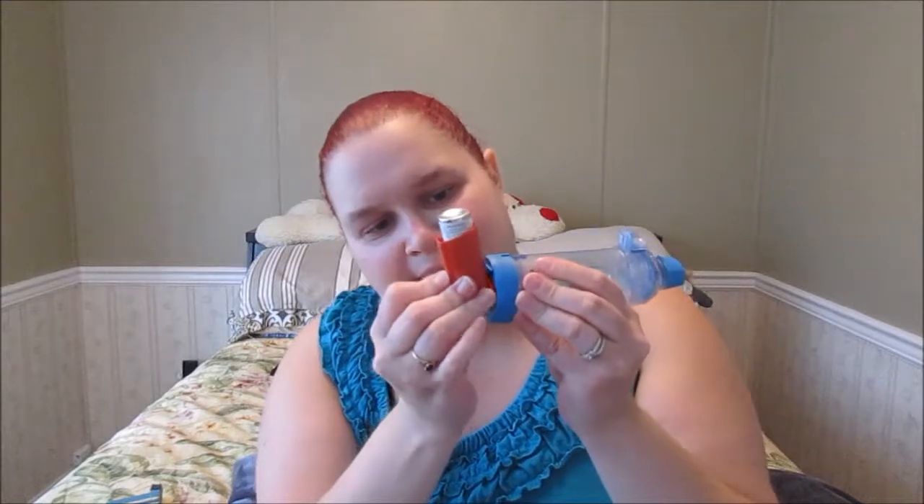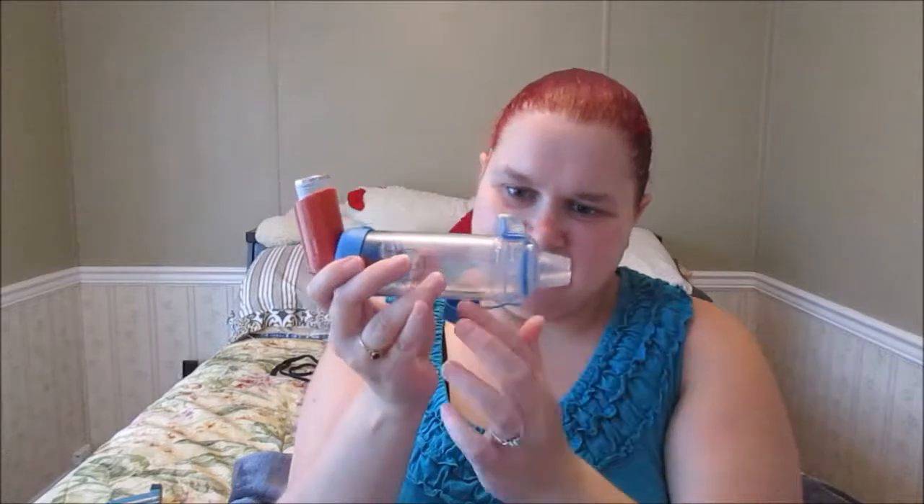I'm going to start with my steroid Flovent because that's the most important one for me. Shake it up for about 10 seconds, then take the cap off and put it to the side. Insert the puffer into the back opening of the aerochamber — it should snug on and not go anywhere. Take the mouthpiece lid off and position it at the bottom so it's out of the way.